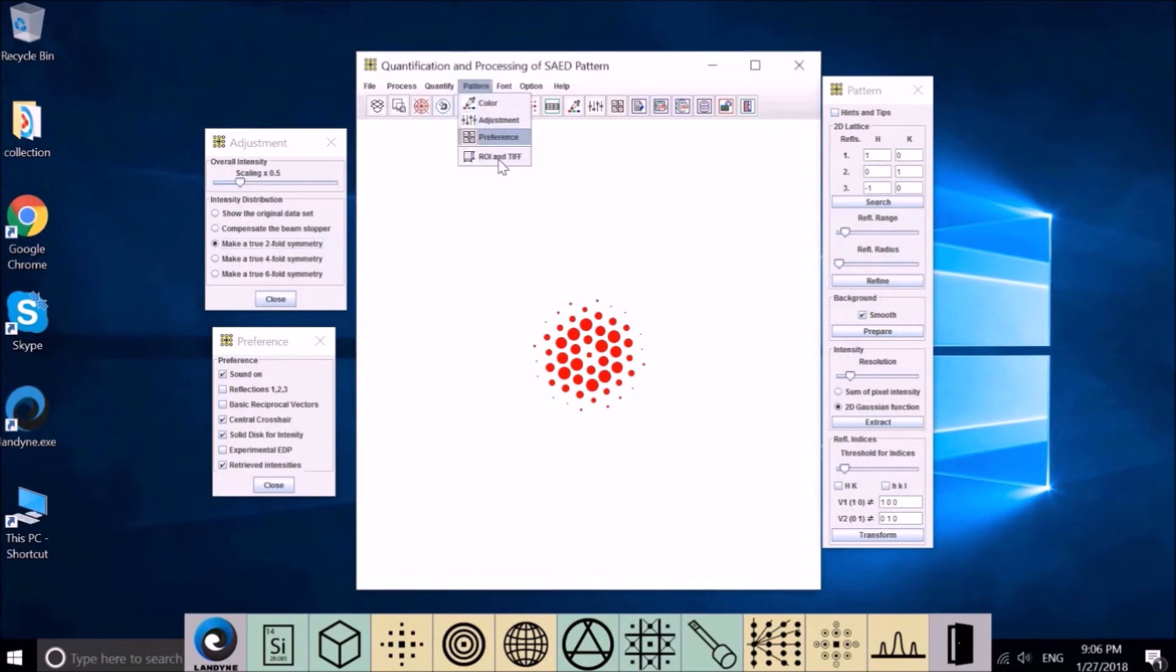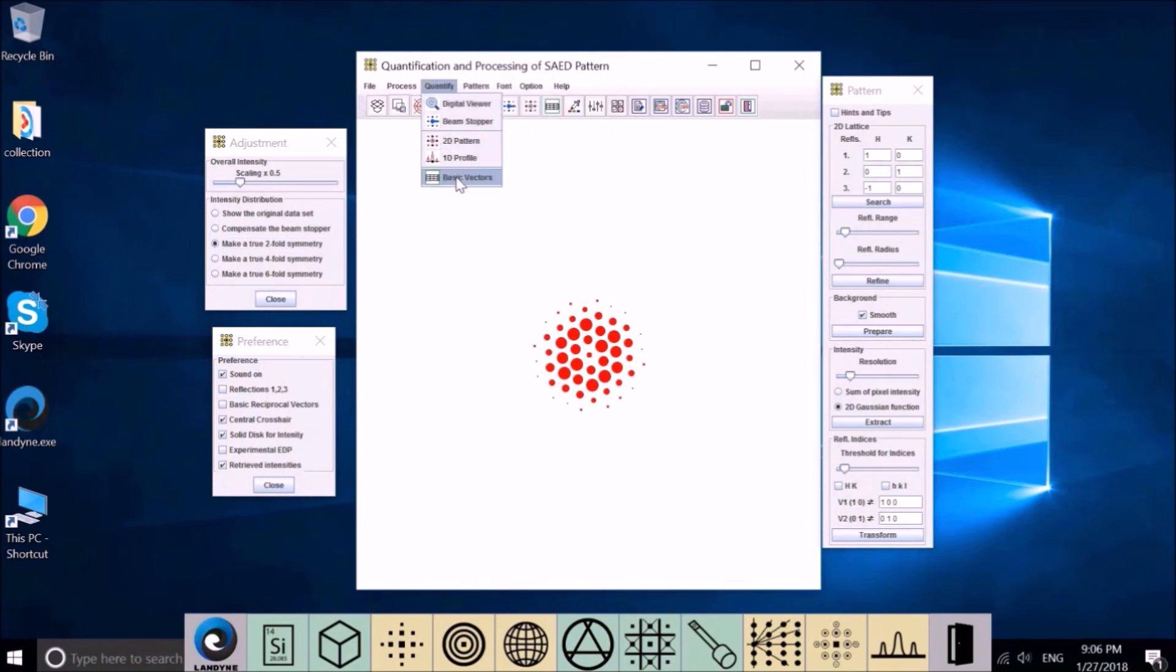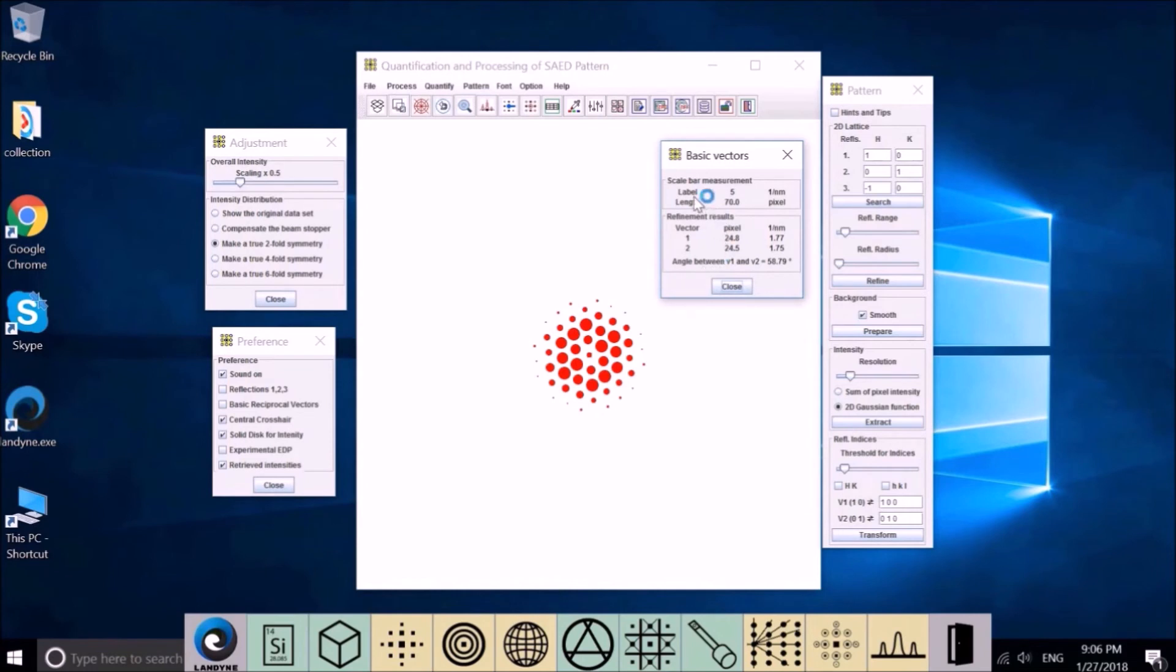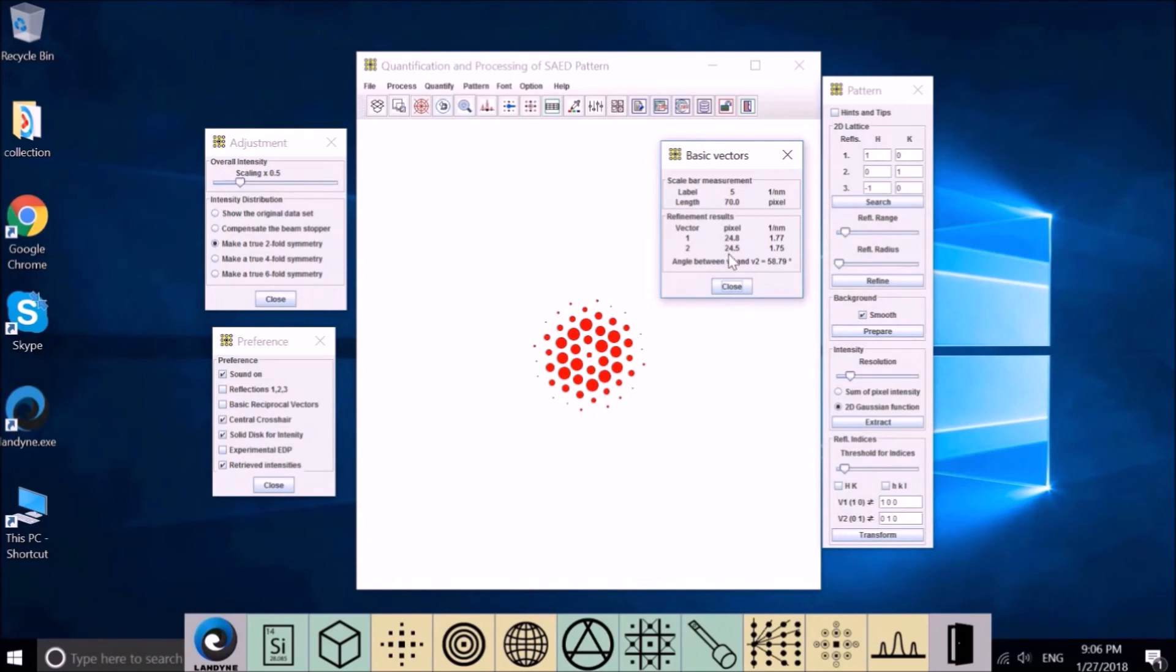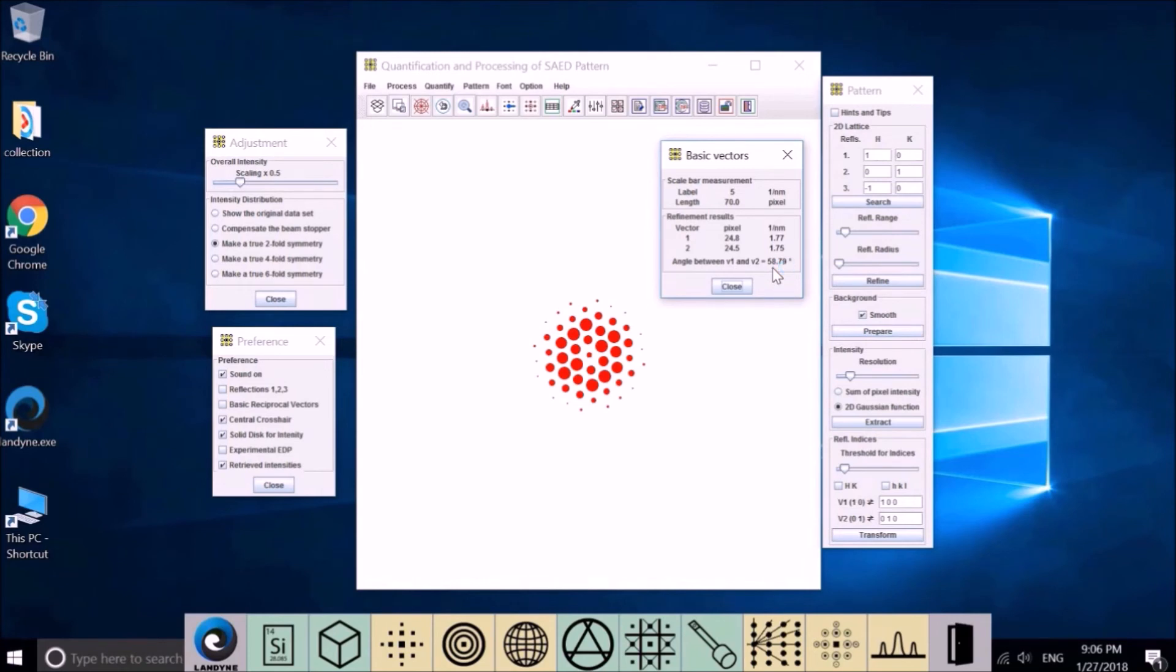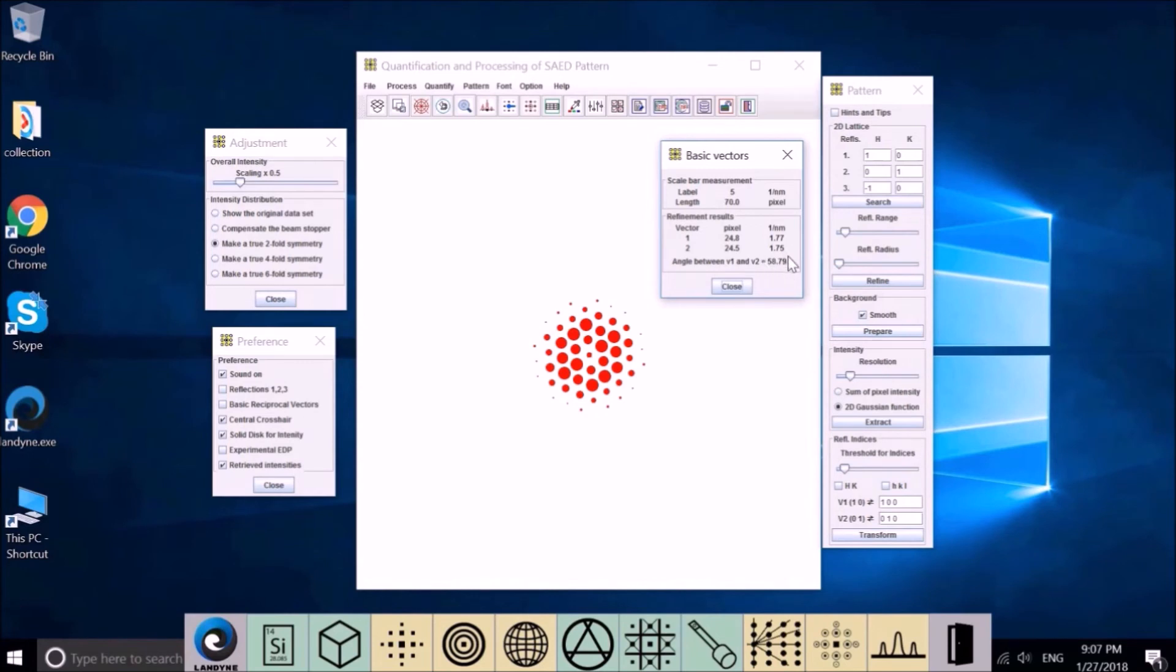We get the intensity distribution. At the same time we get the basic diffraction vectors. We have the scale bar labeled as 5, 1 over nanometer. It measured 70.0 pixels. The basic vector 1 is 24.8 pixels. Vector 2 is 24.5. And this is converted to 1 over nanometers. See these two factors are slightly different.